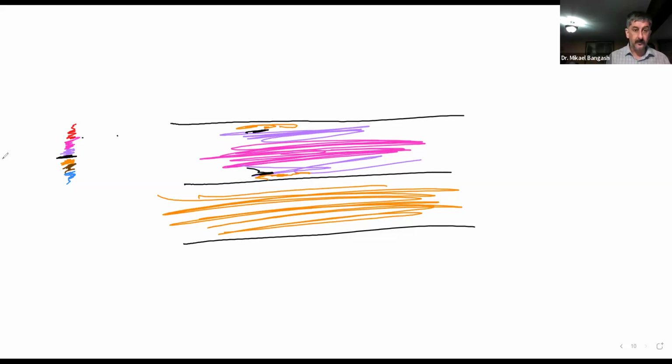Now, if we, for instance, use Mr. Wall filter, what is it that he will do? He, or she, or it will eliminate or get rid of the low Doppler shifts. And what would that mean?